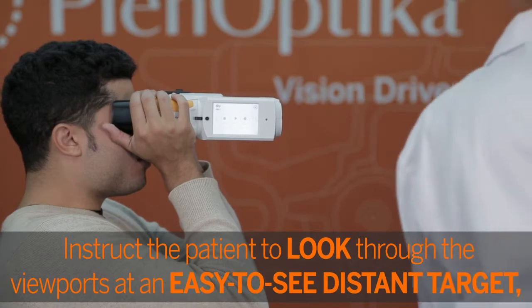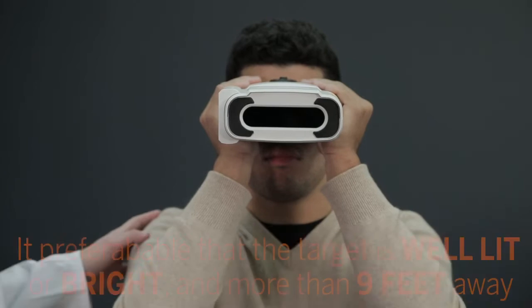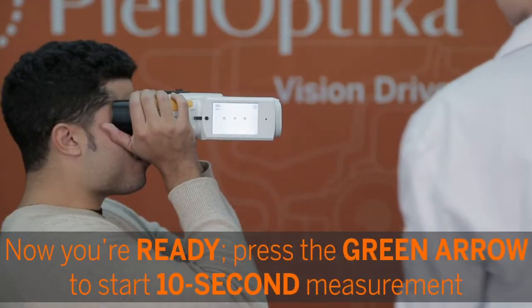Instruct the patient to look through the viewports at an easy-to-see distant target, not at the internal red dot. It's preferable that the target is well-lit or bright and more than 9 feet away. Avoid having the target be something plain like a window or a blank wall. Now you're ready.